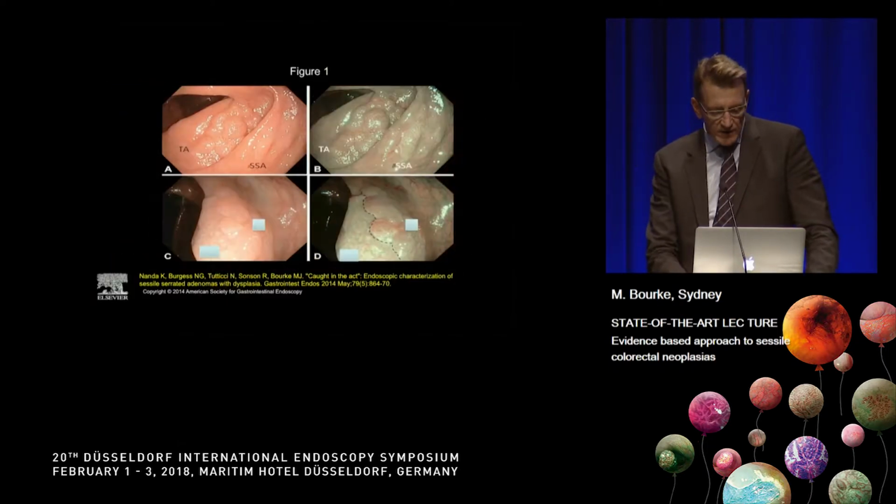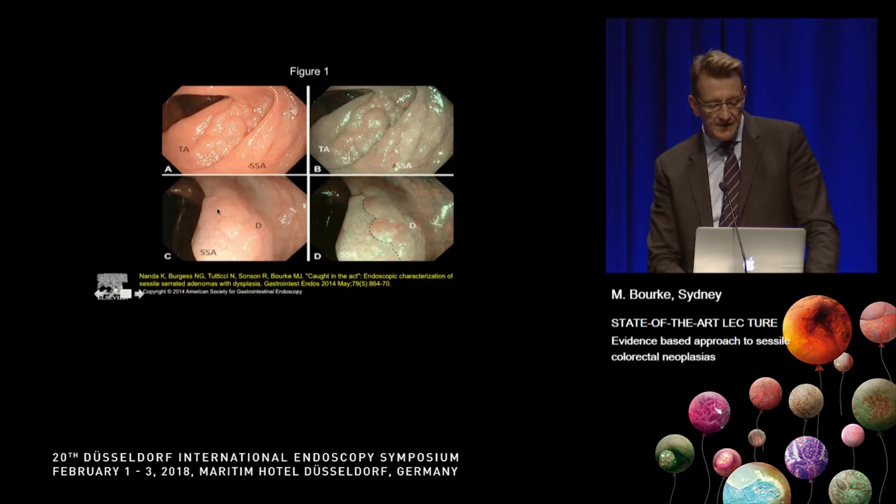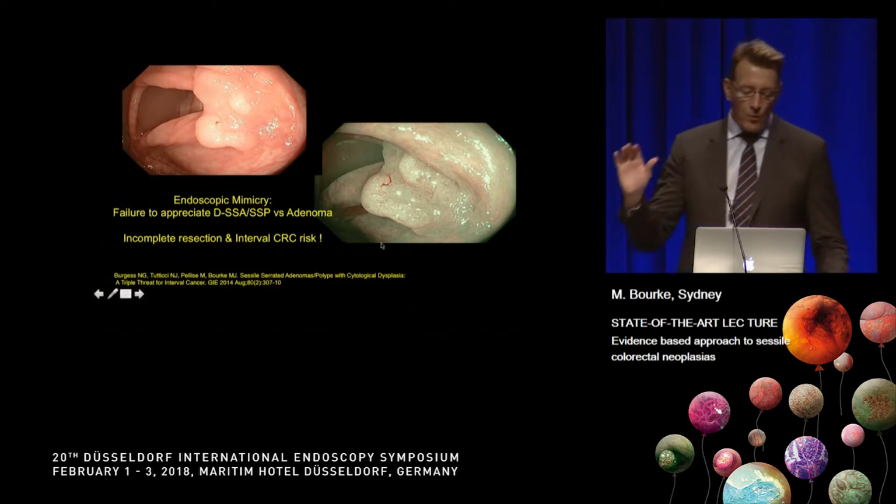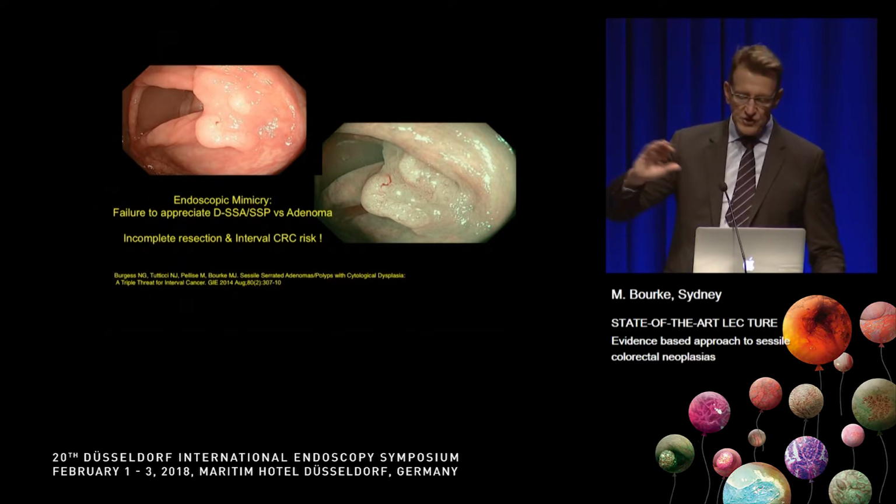And then once we know all that, and we can appreciate that we're not dealing with cancer, when we look at a lesion, we say, well, this is an adenoma, or it's a serrated lesion, or indeed we can say that it's a dysplastic focus within a large serrated lesion. And I hope you can appreciate here the classical serrated lesion and then this dysplastic focus in the clear demarcated zone.